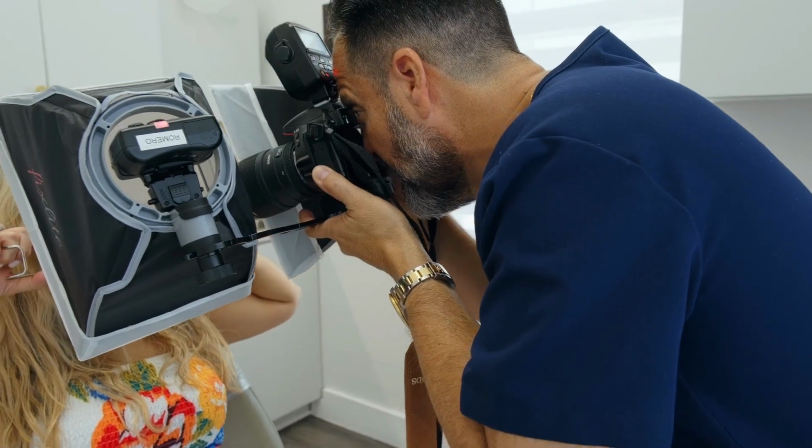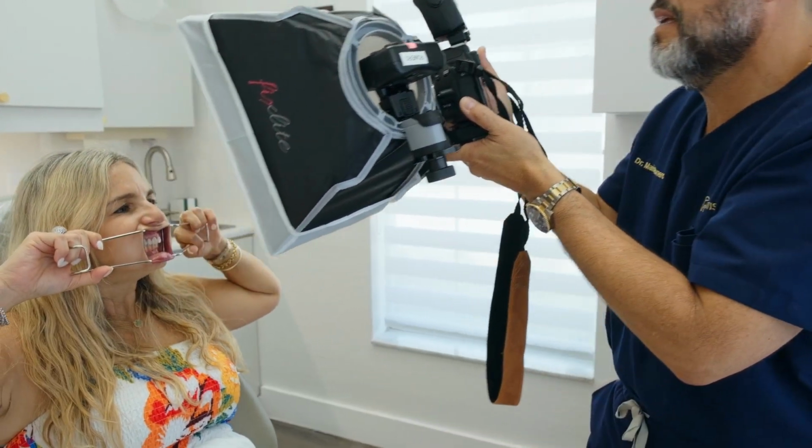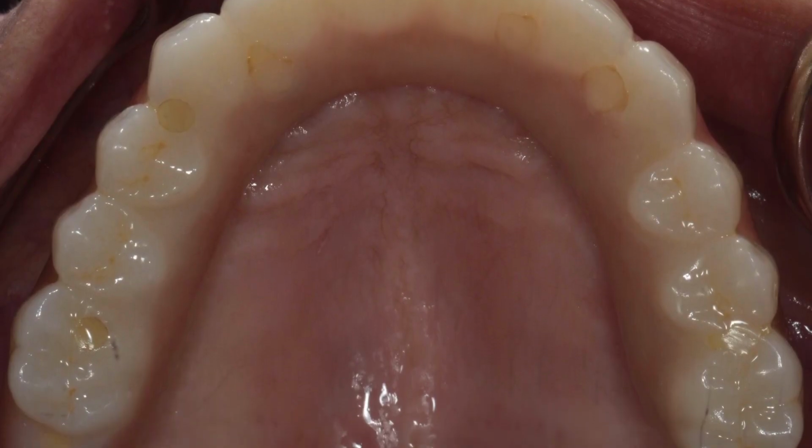So my first step for the great majority of things that I do in my practice is always going to be clinical photos. These are going to be retracted view photos, always a smile photo if it's in the aesthetic zone. But if it's not in the aesthetic zone, I'm going to do occlusal shots of the area that I'm going to be working on.